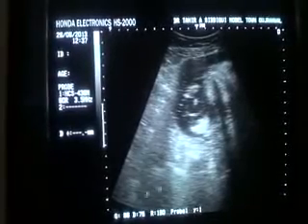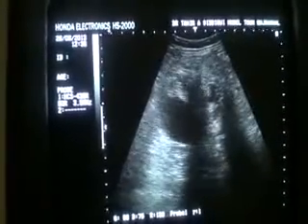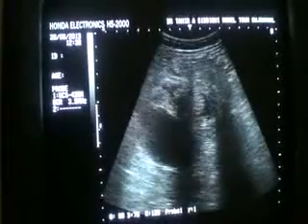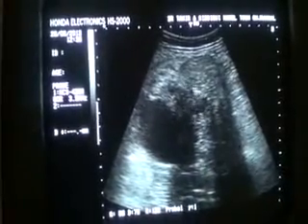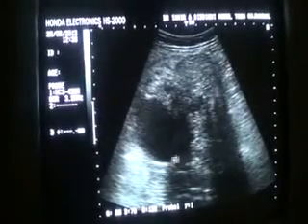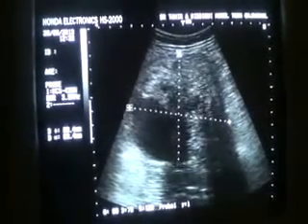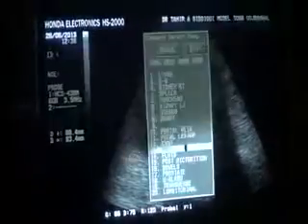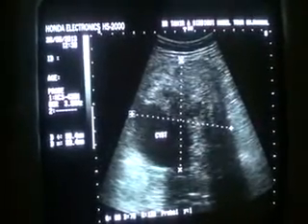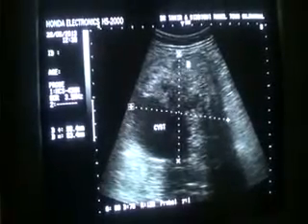See the posterior wall enhancement. The echogenic area within this gives posterior shadow as well. This shadow is coming from this echogenic area, and this echogenic area is not shadowing. These are two other echogenic areas. And this cyst is approximately 10 by 8 centimeters.